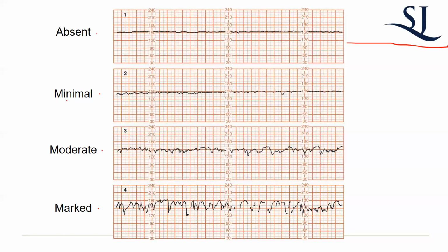That's minimal variability. It will never make it absent though. Okay. That's what you need to kind of remember. And then obviously minimal variability, if you're kind of trending in a direction where there is fetal distress, that's not a great sign. But minimal variability in and of itself and everything else looks okay, like the baseline.